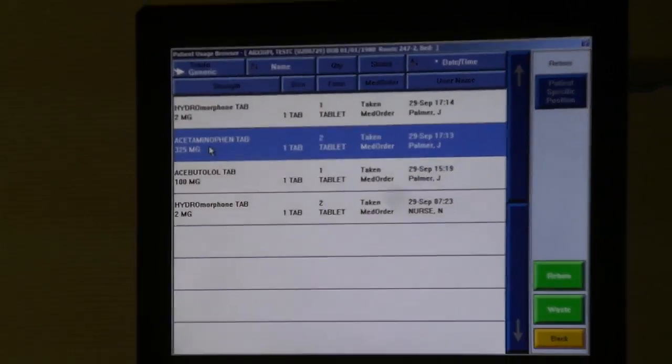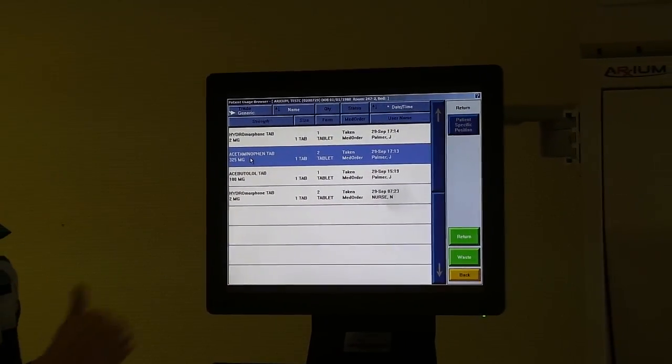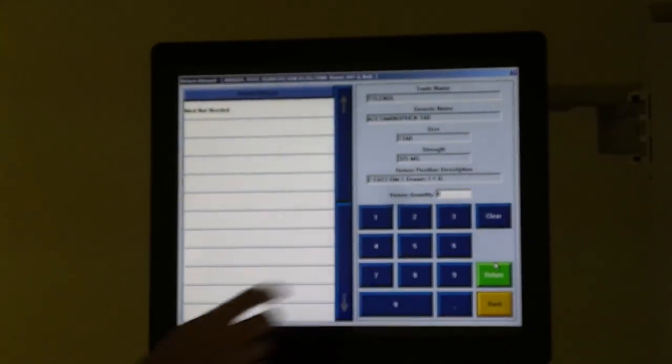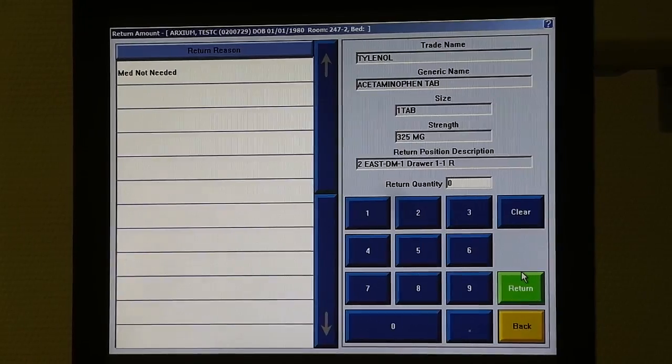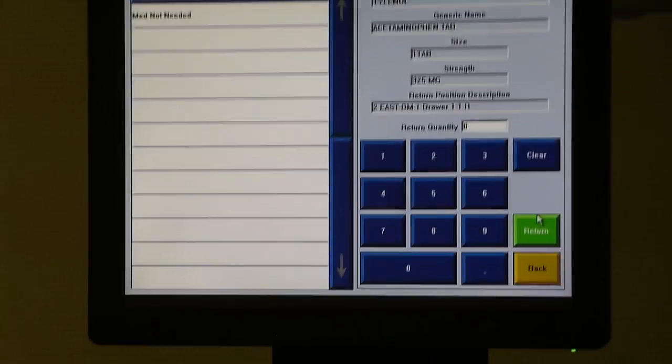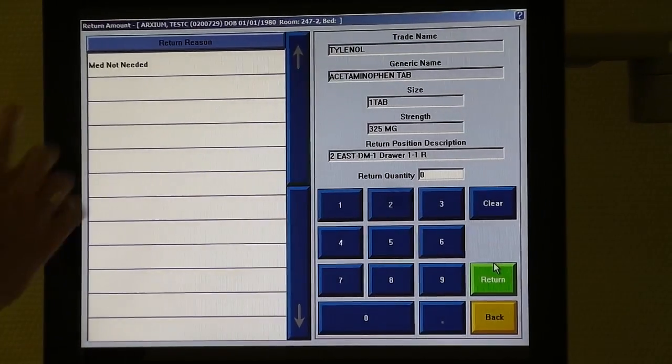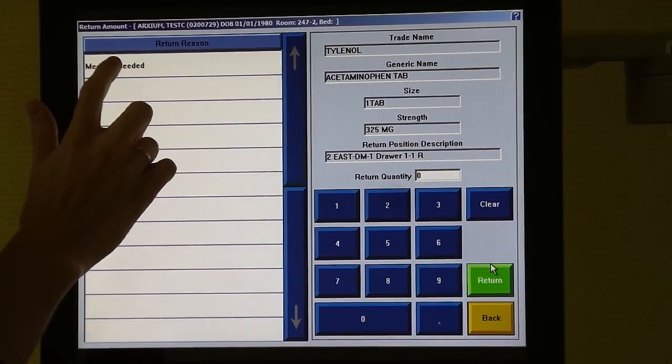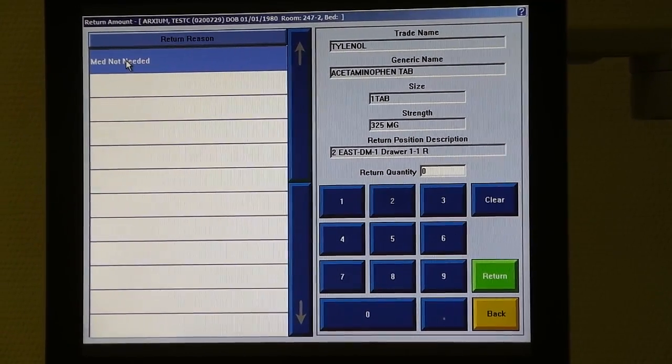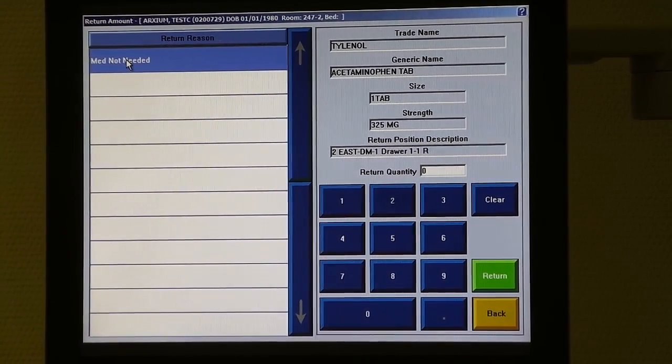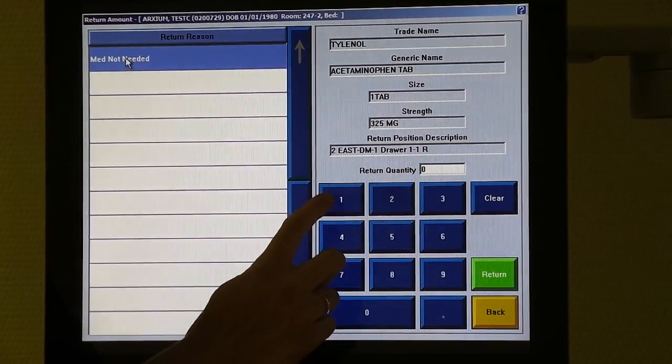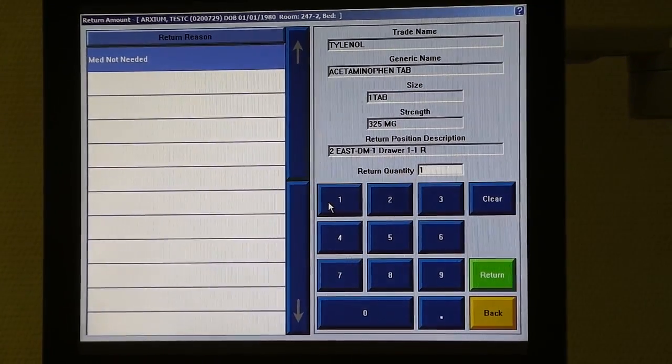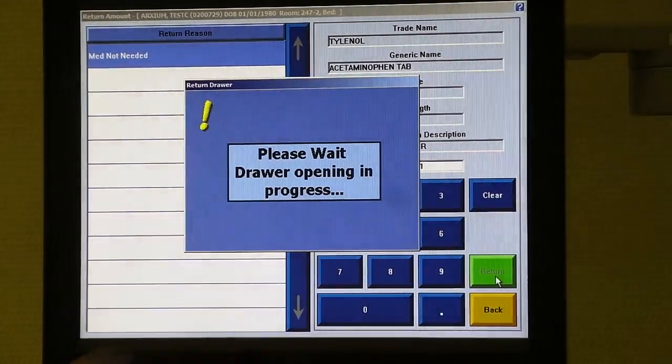I'm going to simply select the medication and hit return. I'm going to be prompted for a reason. In this case there's only one reason to choose, though you will have more choices at the live station. Select the reason, enter the quantity that you are returning and simply hit return.